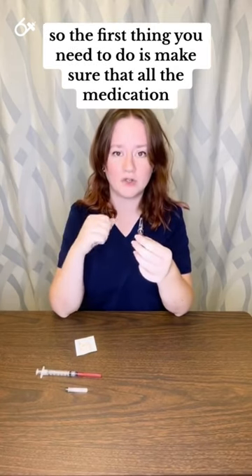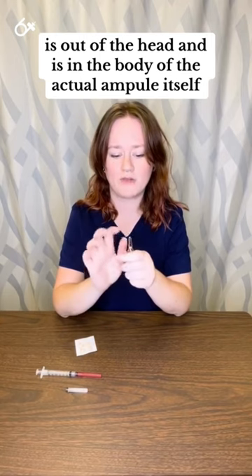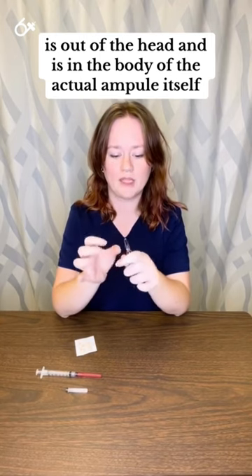The first thing you need to do is make sure that all the medication is out of the head and is in the body of the actual ampule itself.